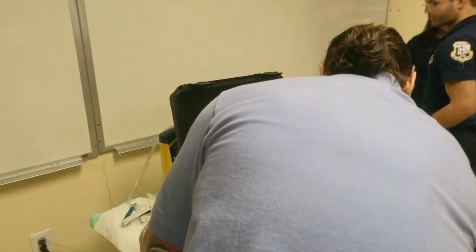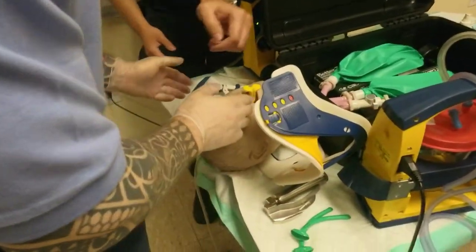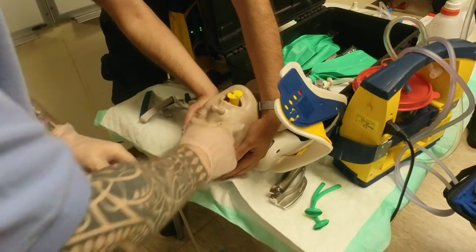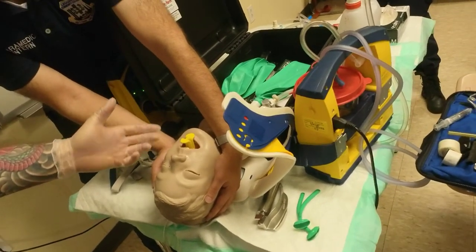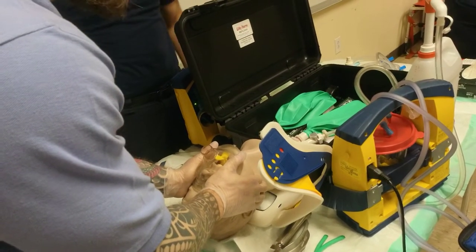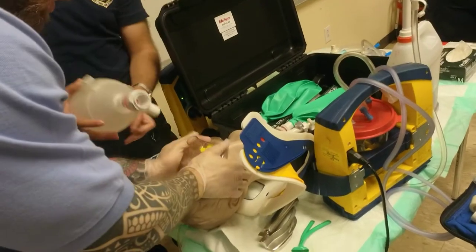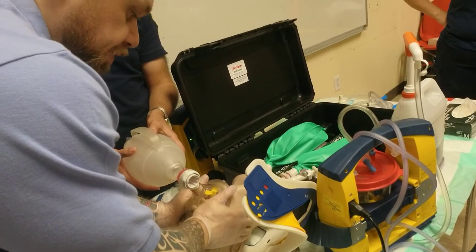I'll have the partner come to the side and do MILS. The jaw has to be mobile. If the patient did not have any airway contaminants and was desaturating, I would disconnect the mask of the BVM, open the cuffs, place it on the mouth and nose, and then from the head position I lift the jaw every time the breath is delivered. I'll tell you squeeze on six, and I'm going to engage on five: two one-thousand, three one-thousand, four one-thousand, five one-thousand, squeeze — six.